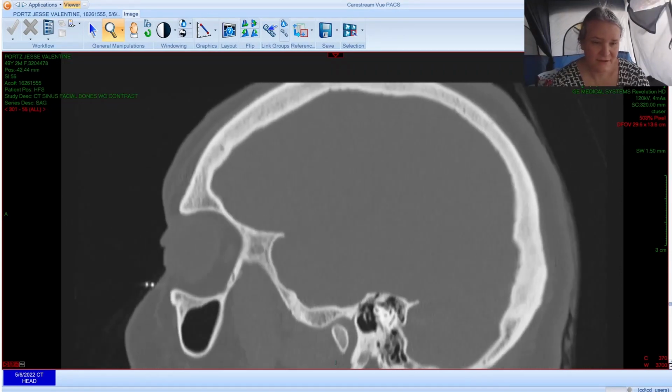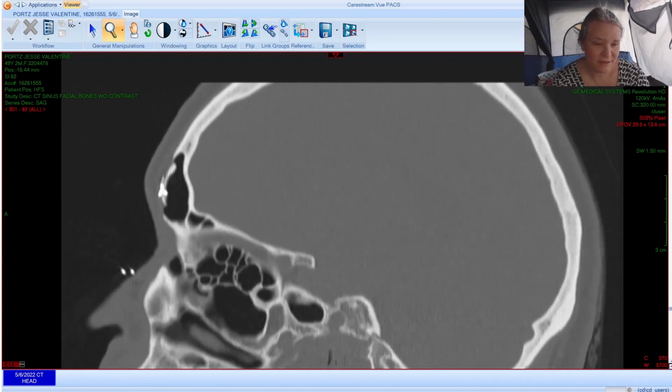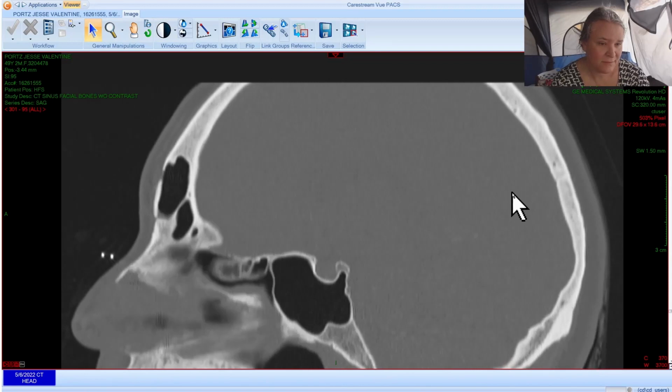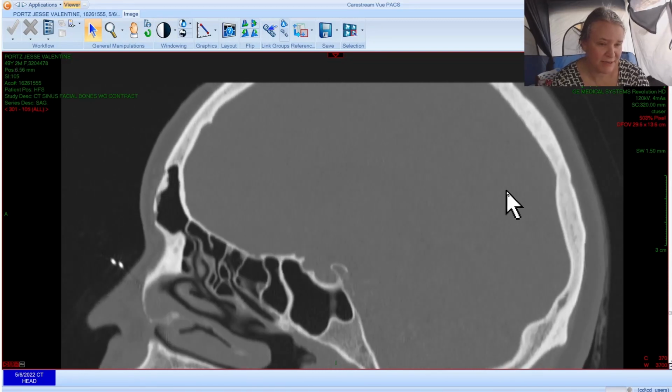And here's the side view. And that's what the new sinus cavity looks like. Radically different. You can see how these pieces of bone haven't really healed in yet. I've taken a piece of bone and shifted it back. And so it's nearly flat now in that location.